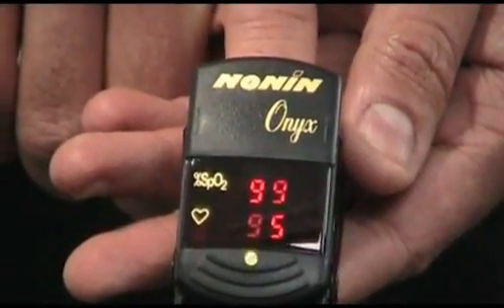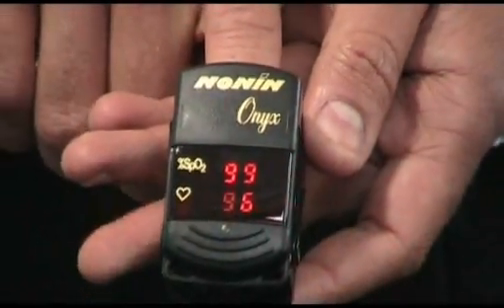One feature of the unit is the single signal strength readout. Green indicates a good signal strength, yellow means caution, and red shows a bad readout.